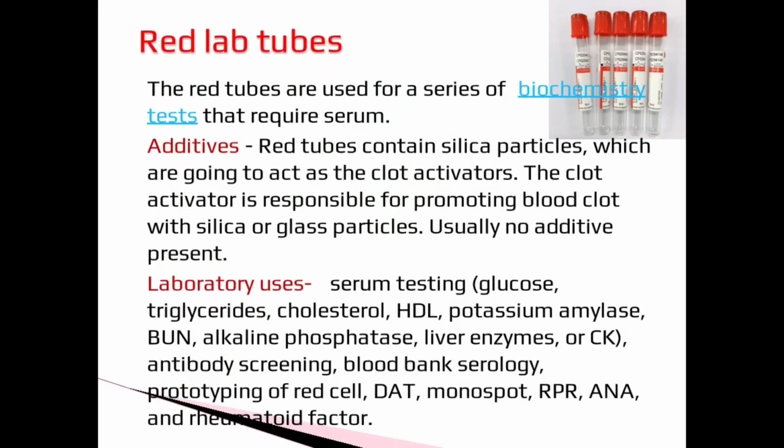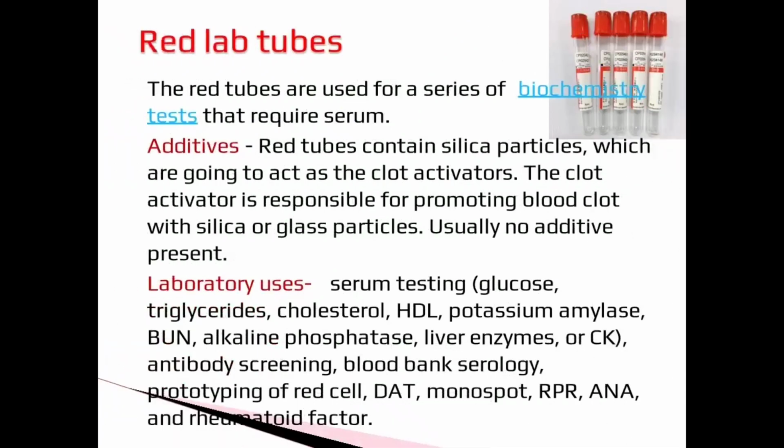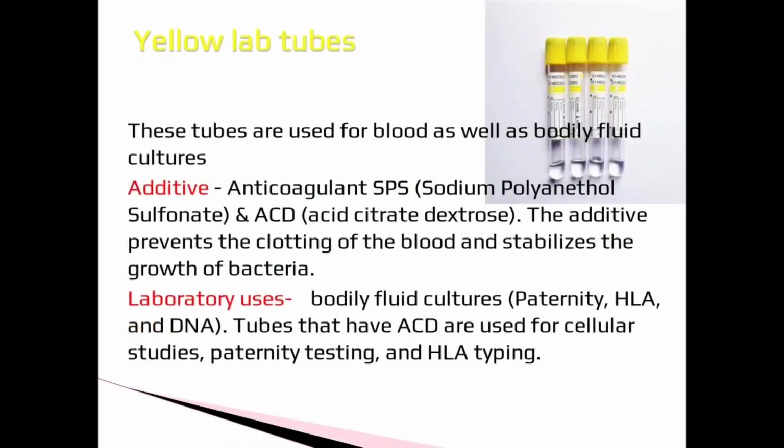The red test tubes are not commonly used. They are used for a series of biochemistry tests that require serum. Commonly used additives are silica particles, which act as clot activators. These tubes are used in various serum testing, for example glucose, triglycerides, cholesterol, HDL, potassium, amylase, etc.